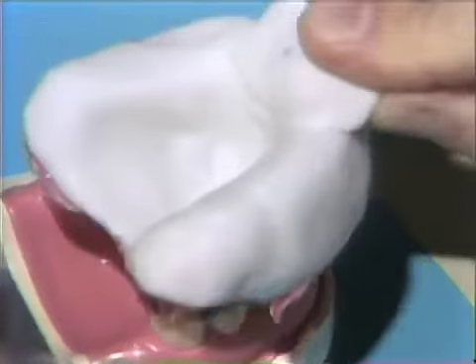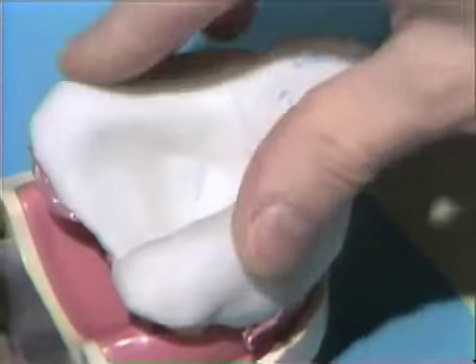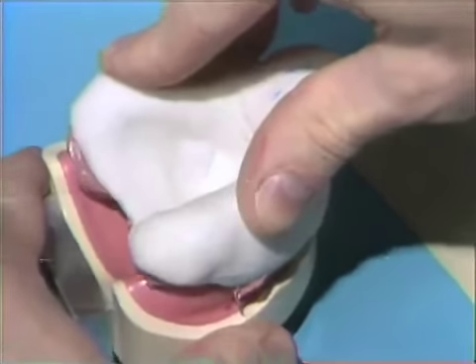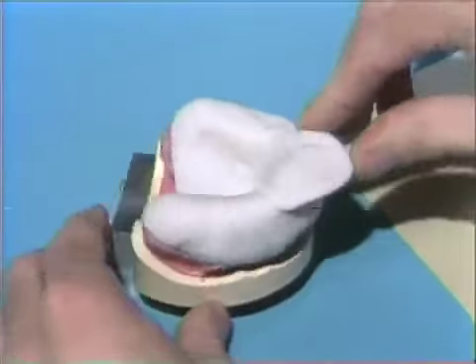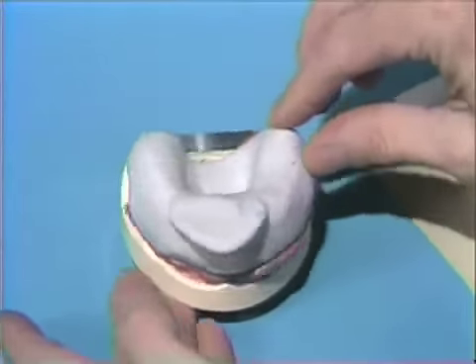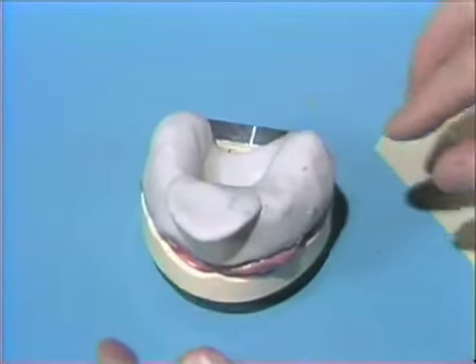We'll now take the tray and seat it down on top, then set it aside and wait until it has fully set.